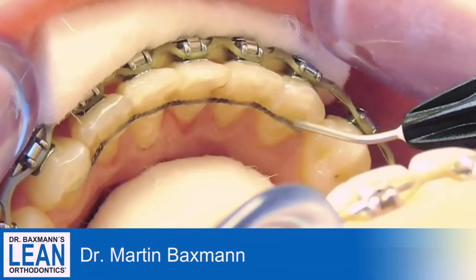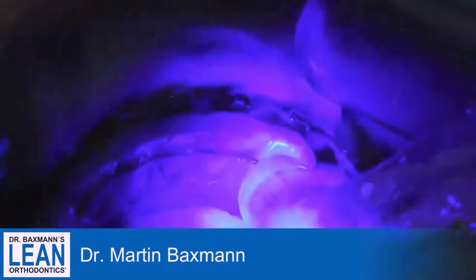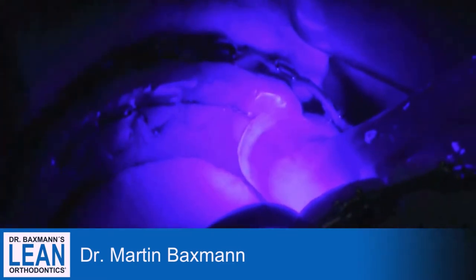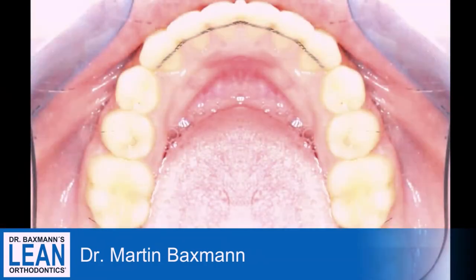Adjust it, light cure it, add some little tiny bits so it's really smooth, light cure it, and then it's done already.